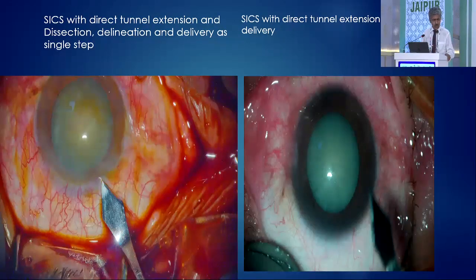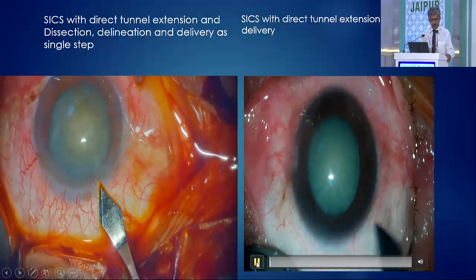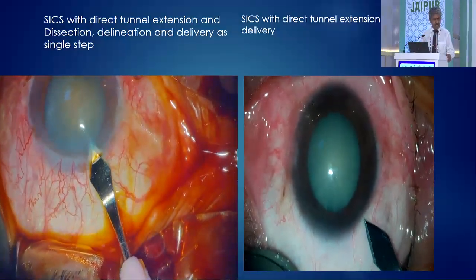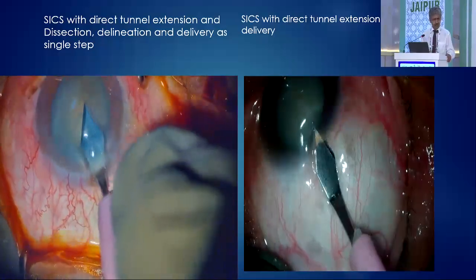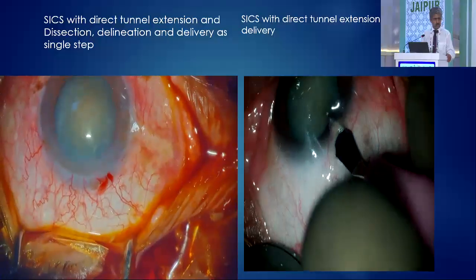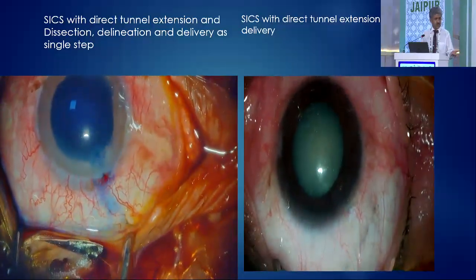I'll be showing you two videos, if they run simultaneously, both on small incision cataract surgery with a simple, easier technique. You just go like phaco emulsification. This is the posterior limbal incision. You put a stab incision, and you can do phaco also, and you can do small incision cataract surgery also.